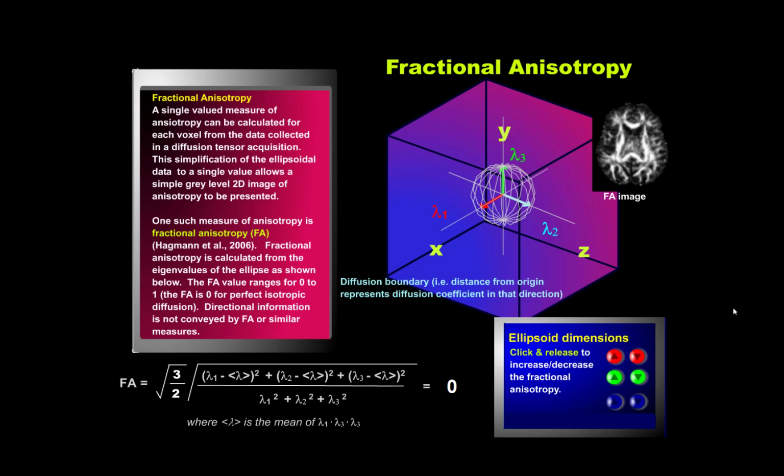Another concept in DTI is fractional anisotropy. So if you're looking at a fractional anisotropy image or an FA image, what the gray levels are telling you is how anisotropic a given pixel is, okay, which sounds pretty confusing, but that really means that if the contents of the voxel are very directed, then that voxel will be highly anisotropic.